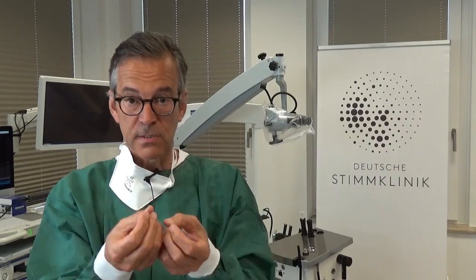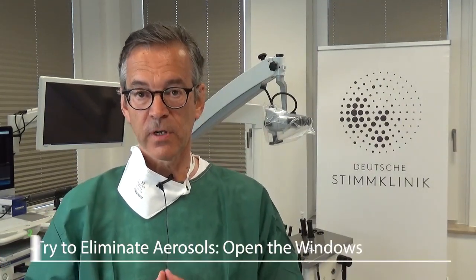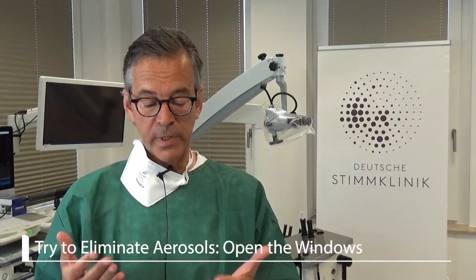What can we do to protect our patient and ourselves while we are close to the patient? Can we cover the mouth? Can we cover mouth and nose? How do we handle the endoscope when it comes to infectious secretions that we touch? Of course, we have to touch the nose and we are very close to the mask. Can we do that alone, or do we always need an assistant or even two assistants? How do we handle the potentially infected endoscope and hand it over to the assistant?